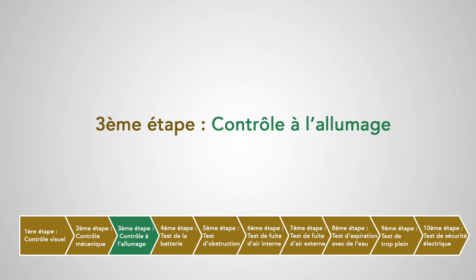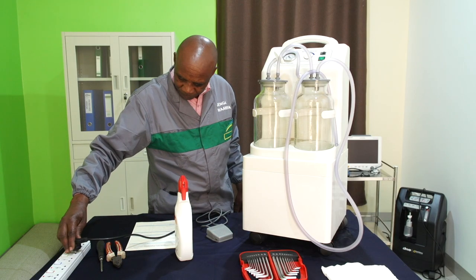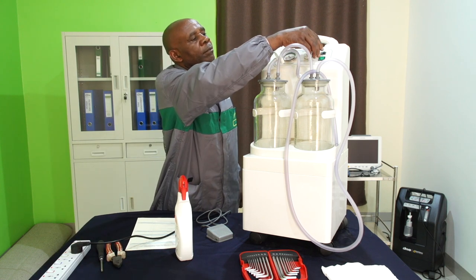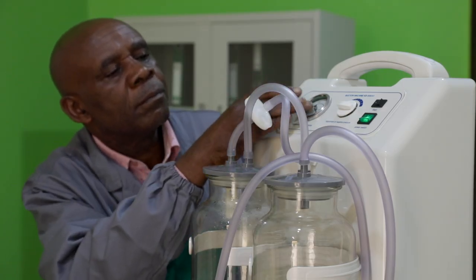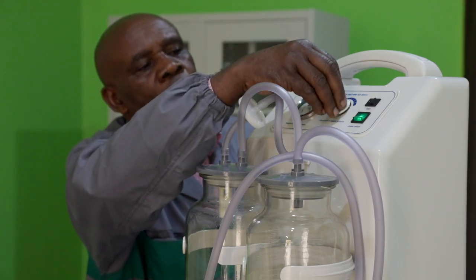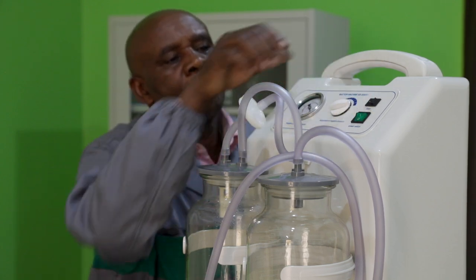Troisième étape : contrôle à l'allumage. On va brancher et allumer notre appareil et vérifier que tous les voyants s'allument et qu'un bruit de moteur-pompe se déclenche au moment de l'allumage. On va ensuite vérifier le fonctionnement des boutons et vérifier que le manomètre est réglé sur zéro lorsqu'on arrête l'aspirateur.